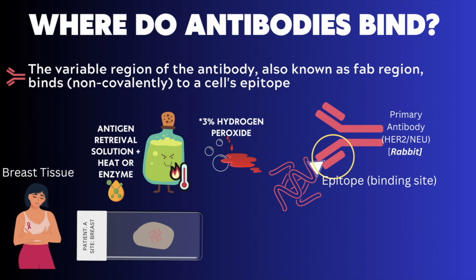Before we apply the primary antibody, one more thing must happen. We need to block the endogenous peroxidase inside the tissue slice. Endogenous is a word that you will hear quite often when discussing IHC. It is referring to something that has originated inside the tissue. Endogenous peroxidase is a natural part of blood. In IHC, we must block the endogenous peroxidase before going forward. We do this by applying 3% hydrogen peroxide. I'll remind you why this peroxidase step was so important further on in this presentation.